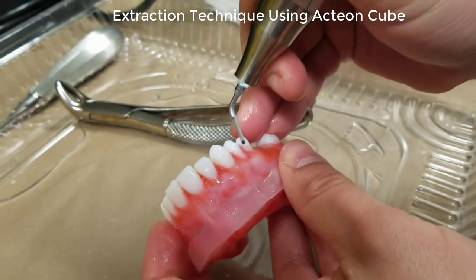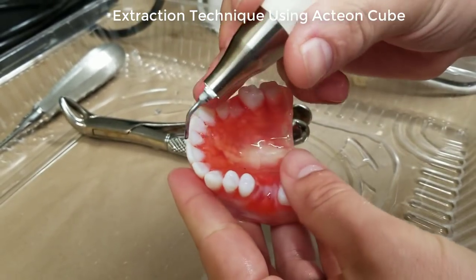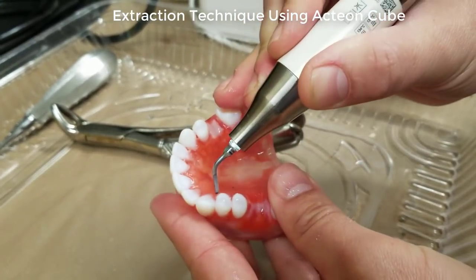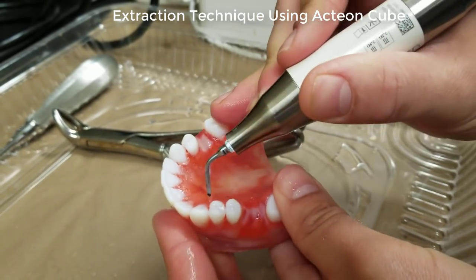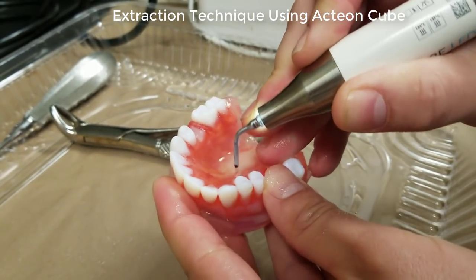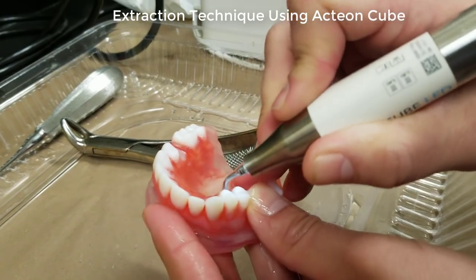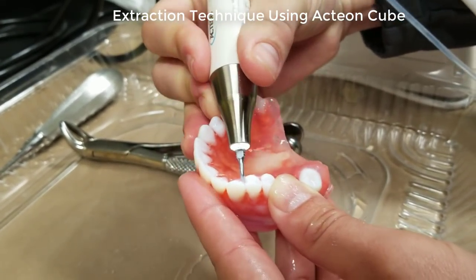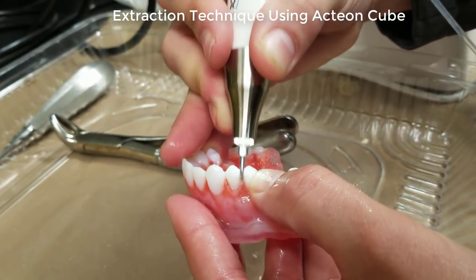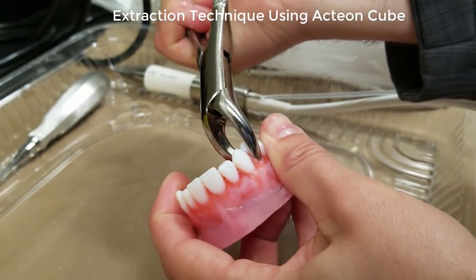We've developed — or we utilize — a technique with this Piezotome that we feel works great for us, and that's using a series of vertical osteotomies circumferentially around the tooth, as you can see on the model here. We feel it's very important not to leave the Piezotome tip down in the alveolar bone for very long, so we use this array of vertical osteotomies, placing the tip down in the PDL space just adjacent to the root surface of the tooth and returning it outside the alveolar bone as soon as possible to allow the tip to cool.